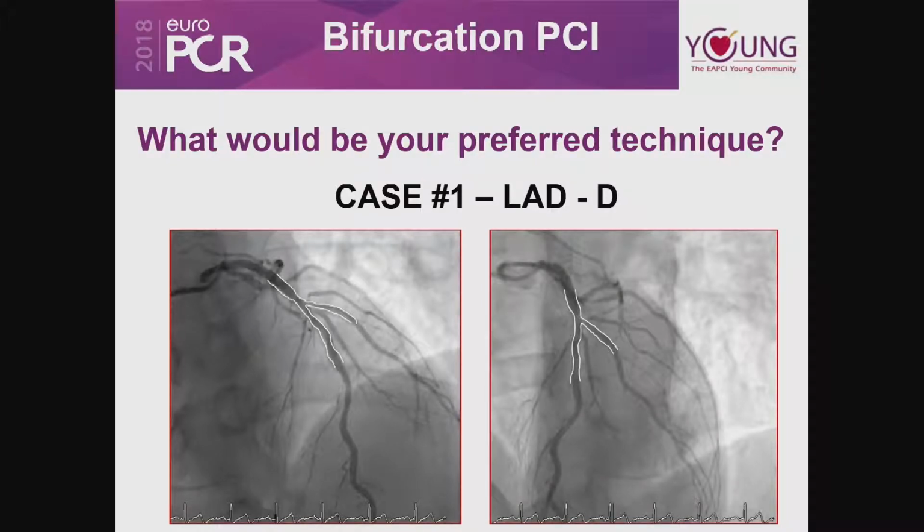Proximal main branch, is it diseased? Yes. Distal main branch diseased? Yes. Side branch diseased? Okay, so let's say the bird's-eye view. It says all three branches are involved. Okay, but then let's go on.